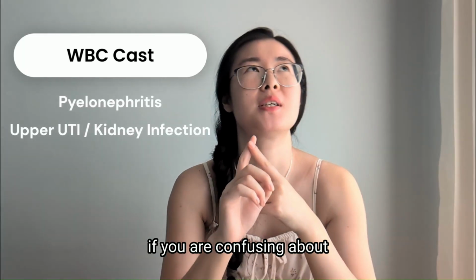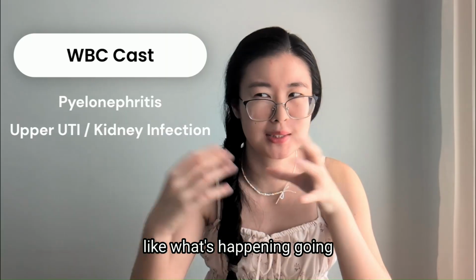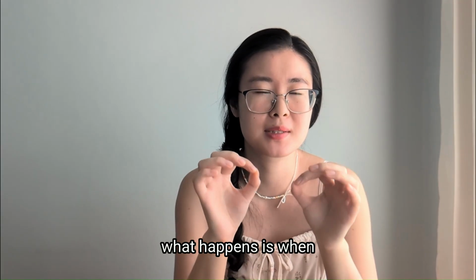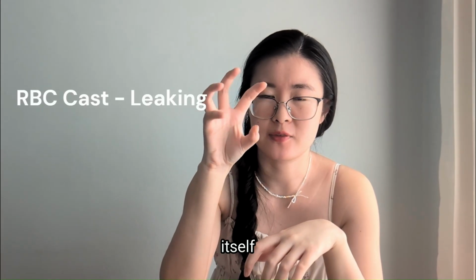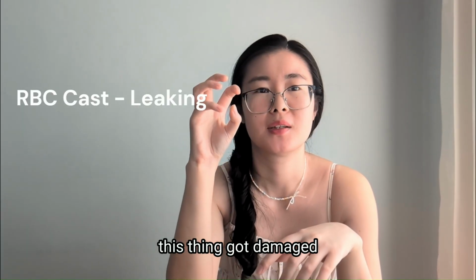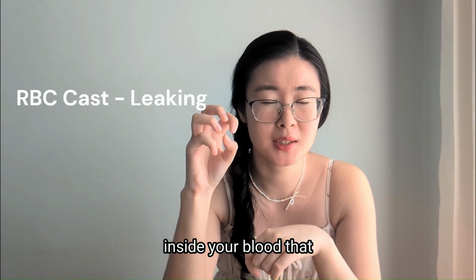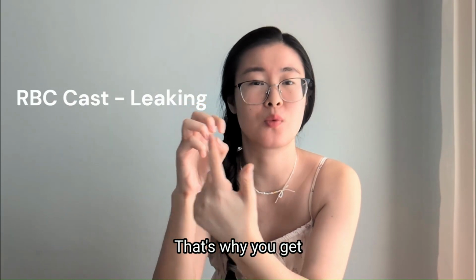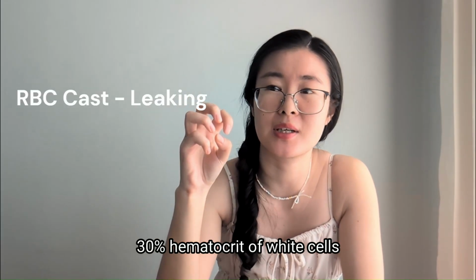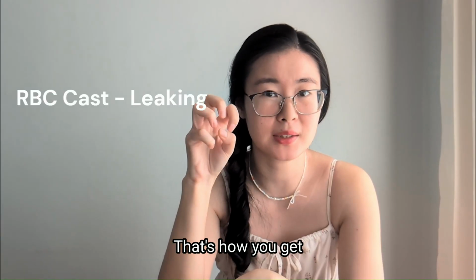Well, if you are confused about why in this case you got a white cast instead of a red cast, like what's going on over here? So the red cell cast, what happens is when your filtration itself, this whole mechanism, your little glomerular filtration, this thing got damaged. That's why your red cells leaked into it. Majority of the cells inside your blood that need to be filtered are red cells. That's why you get the red cell cast. You are not the person who has a 30% hematocrit of white cells, right? Like if you do, you are in trouble. That's how you get the red cell cast.